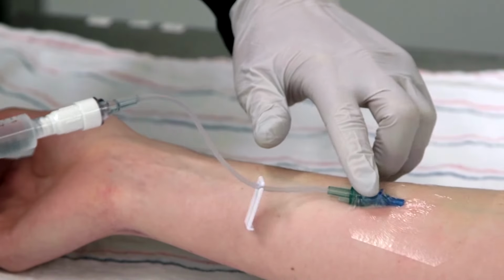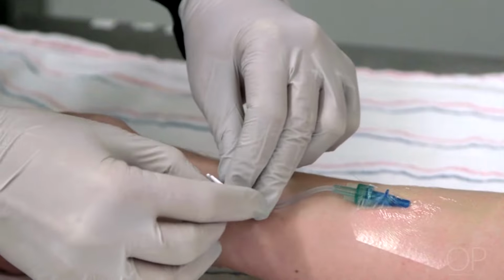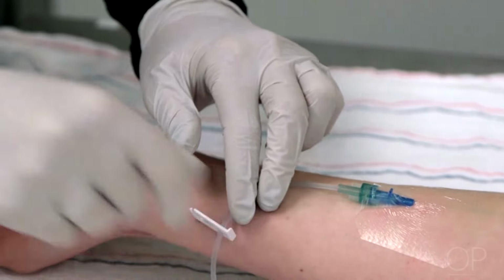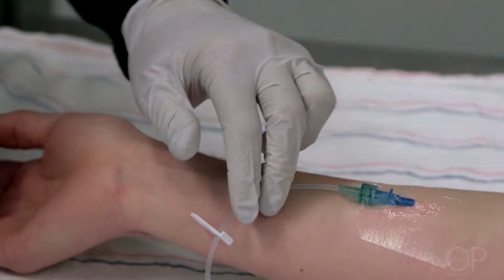Before using the IV, make sure that it is patent for either continuous or intermittent use. If the infusion is continuous, monitor the IV site frequently, at least every hour. Assess the site at the end of IV therapy. Once the IV is placed and deemed patent, place an occlusive dressing that allows for visualization of the site.